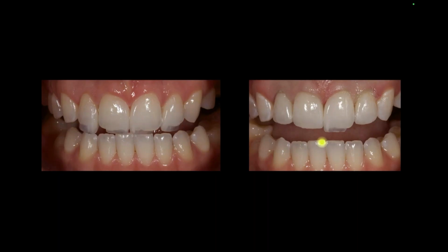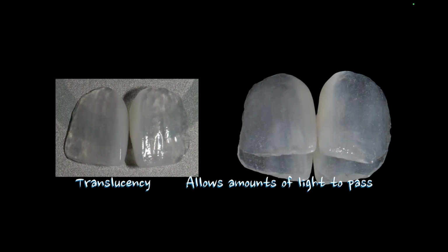So you can notice as I'm sliding these in, let me go back one, look at how translucent I really am. And by the way, getting my ceramic that translucent isn't easy, right? Sometimes you have to overfire it or throw a dot of glazing paste or powder into it just to make sure I create that crazy translucency that I want.